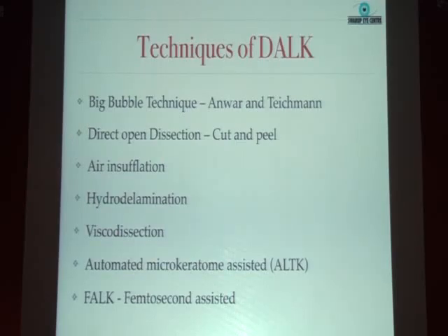The problem in this is once you reach a very deep plane, you really don't know when the Descemet is going to touch your blade or the dissector, and it's very easy to have a perforation if you're trying to bare the Descemet. If you're trying to leave it pre-Descemetic and you're okay with leaving behind a little bit of stroma, you can often do the procedure quite safely, but then your visual outcome will not be as good as a Descemetic graft.